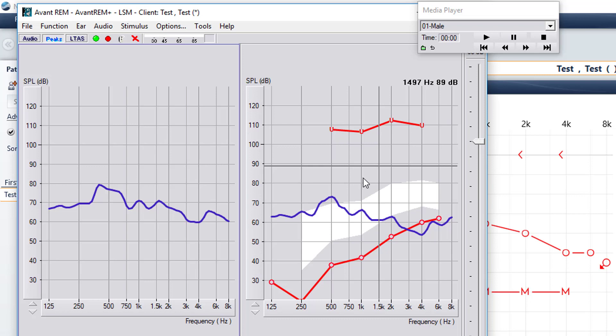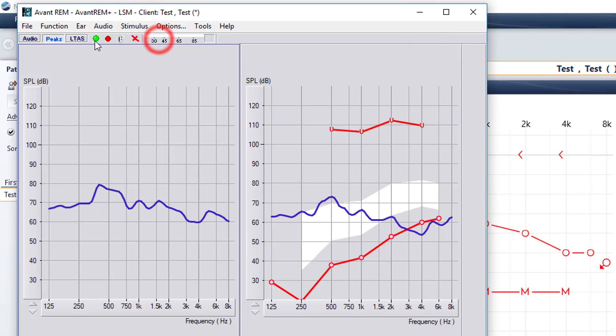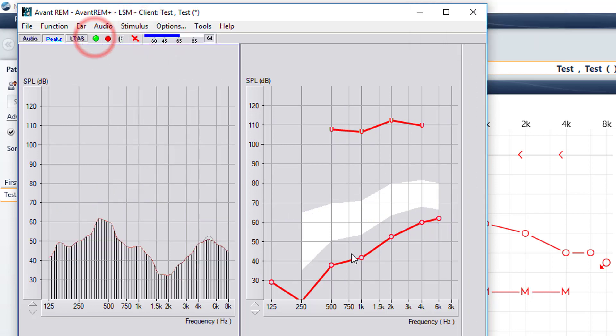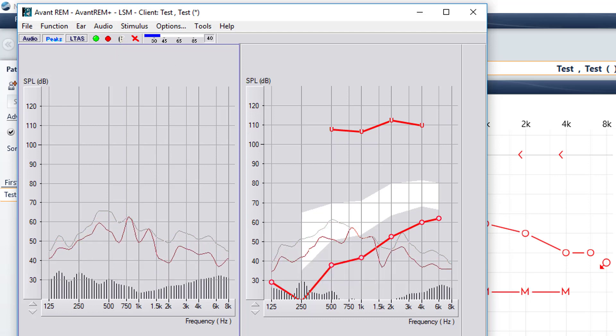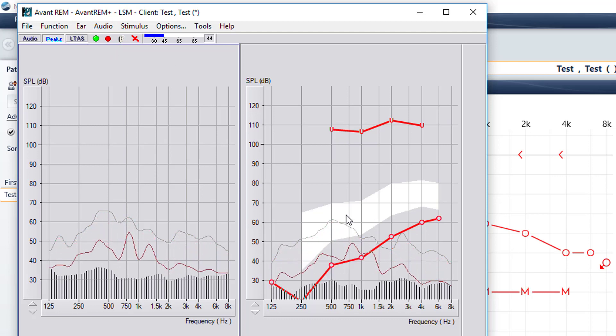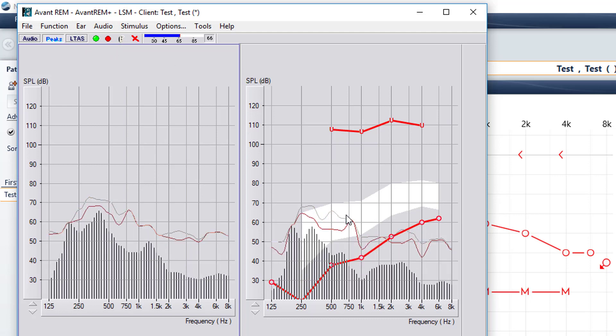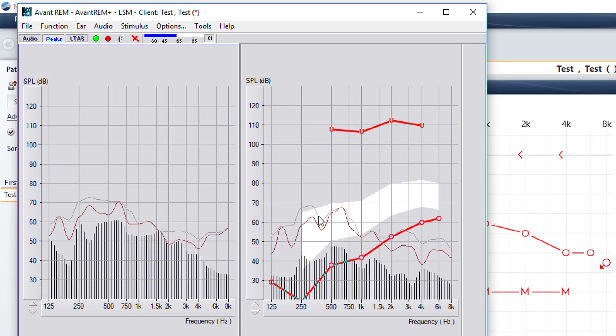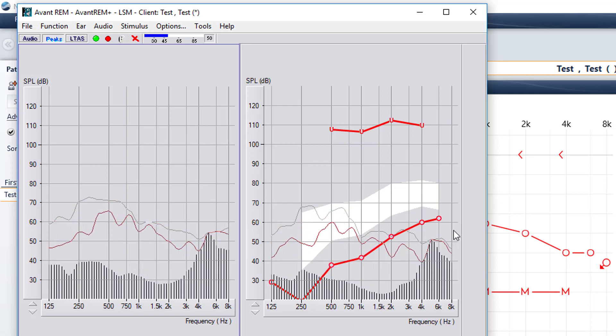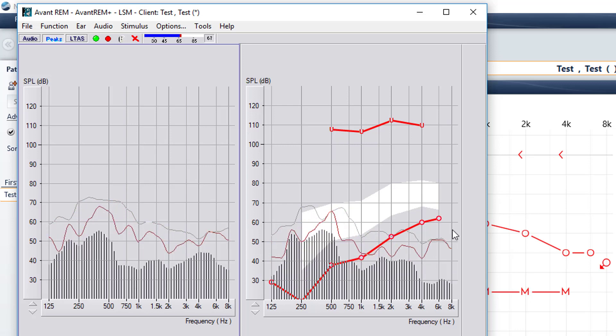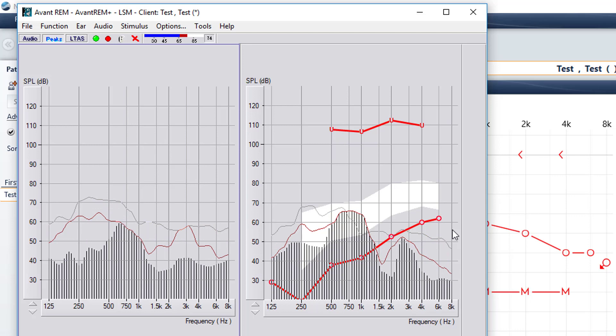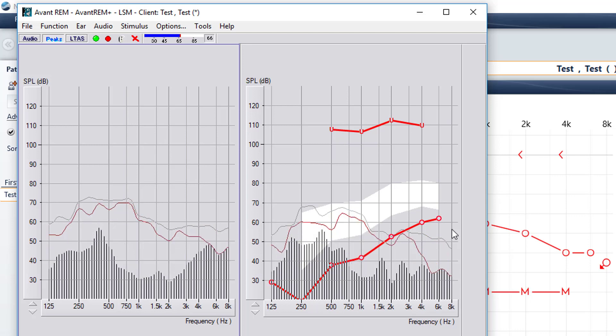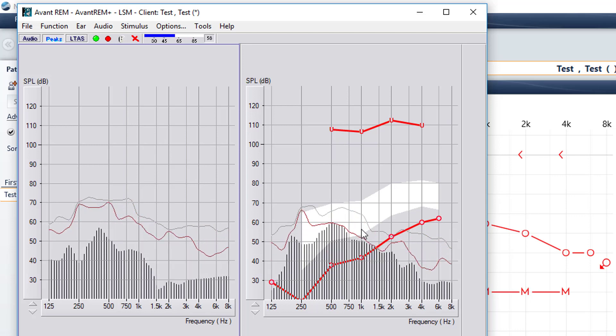I'm going to change the stimulus to microphone so I can show you what's going on. Showing peak sounds, we're measuring in peaks and this thin black line right here is our peak sounds. So technically the file would be playing at this point in time and we know where we are at all times.